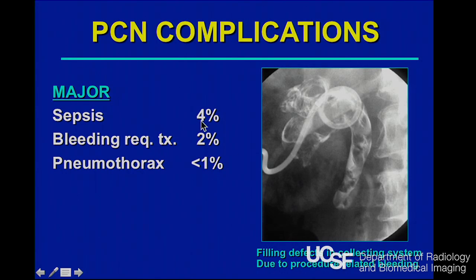Also, particularly for patients who are presenting with infection, you have to worry about sepsis, and for those patients I actually advocate injecting no contrast at all during placement of the tube, and just doing everything under ultrasound and fluoro, or injecting the minimum amount of contrast, not to over-distend that kidney and not to put the patient in septic physiology.